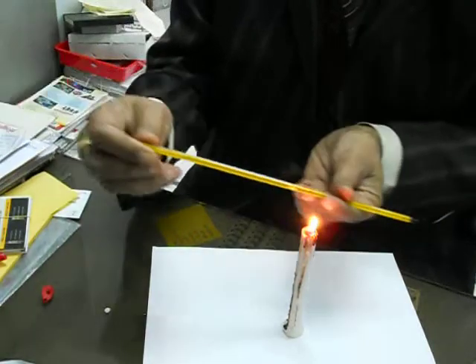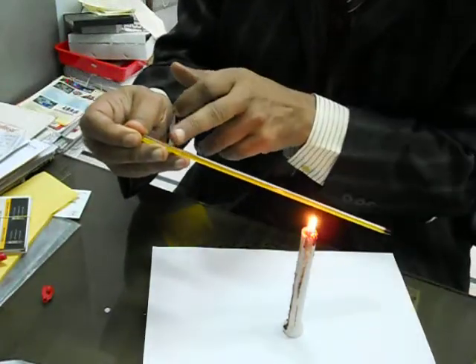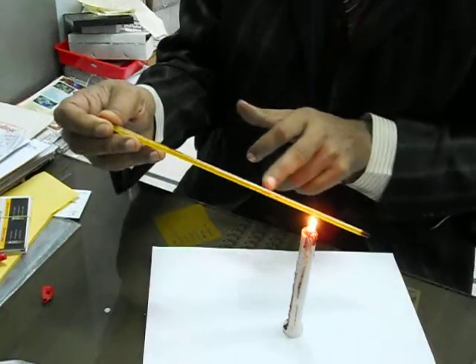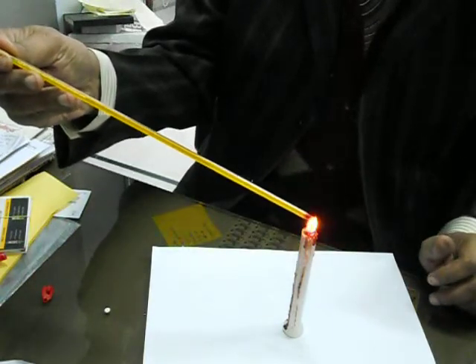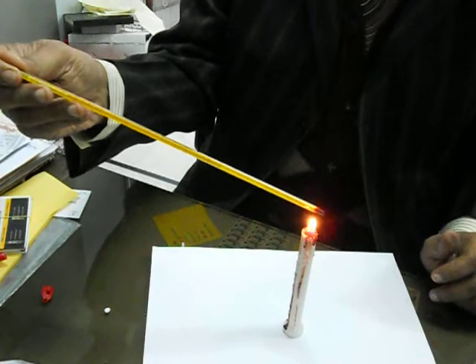Then let it cool down again. As it cools, the column comes back down. Repeat this 3-4 times. The air column will go up and come back down, and the thermometer will start working properly.